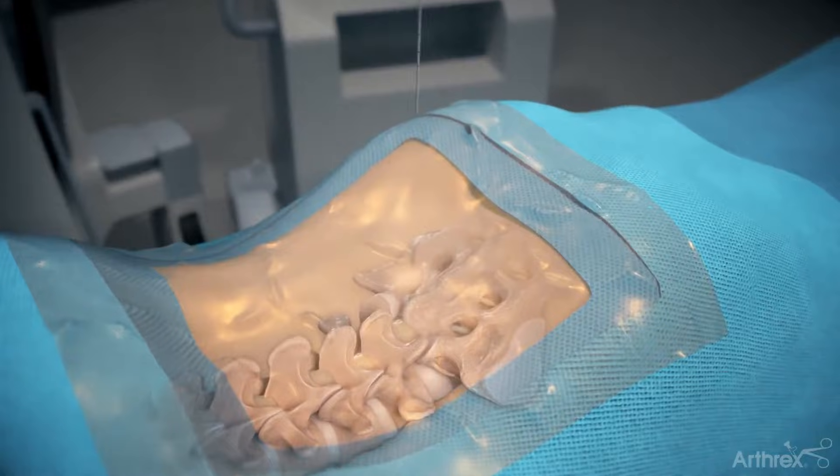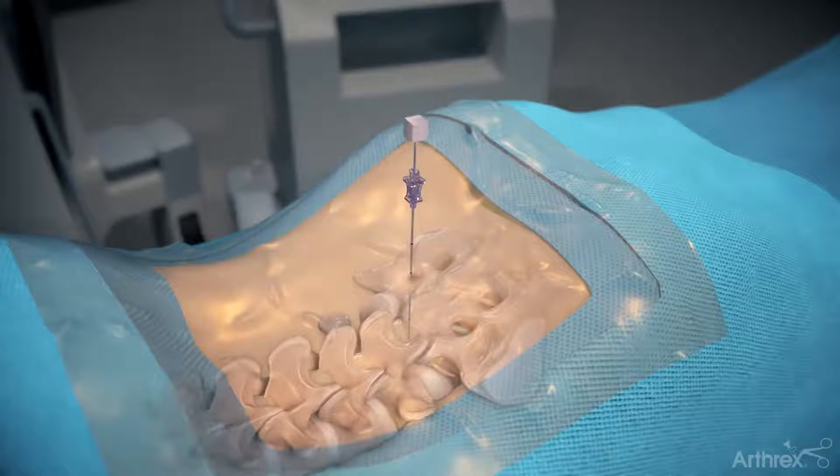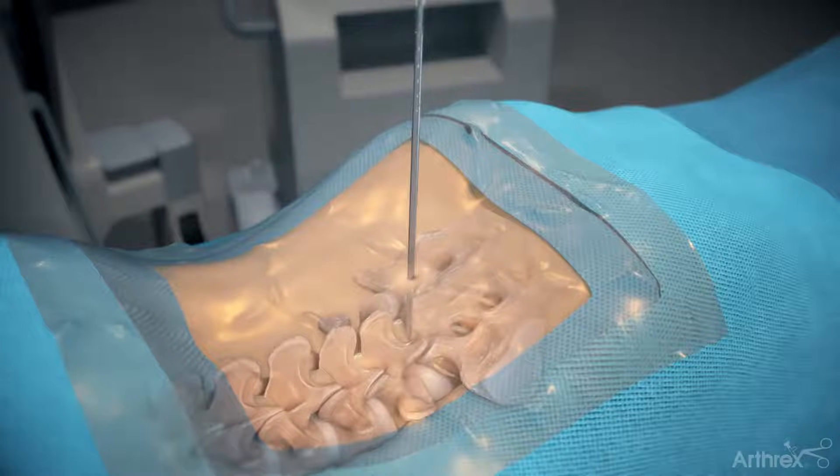Insert a spinal needle, remove the stylet, and pass a guide wire through the cannula, then remove the cannula. Insert serial dilators over the guide wire until the appropriate diameter is achieved. Continue utilizing dilators for Steps 2 and 3.